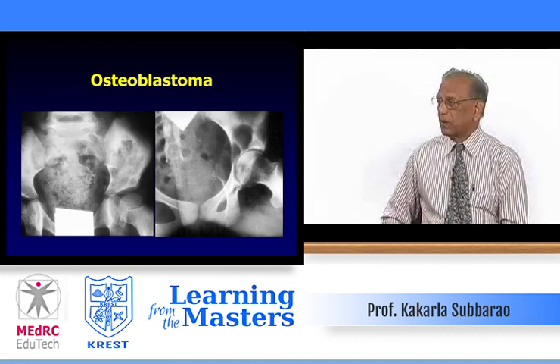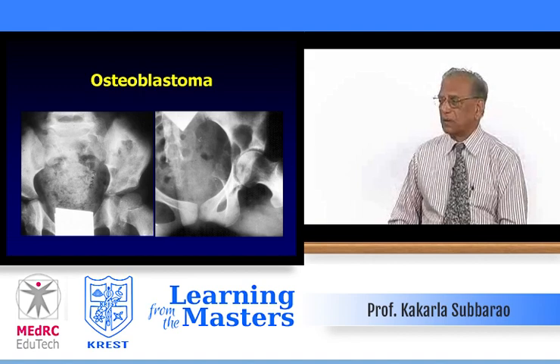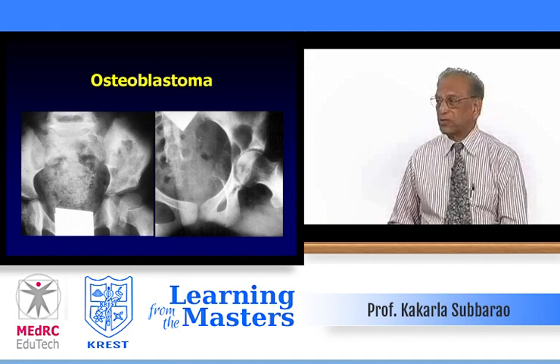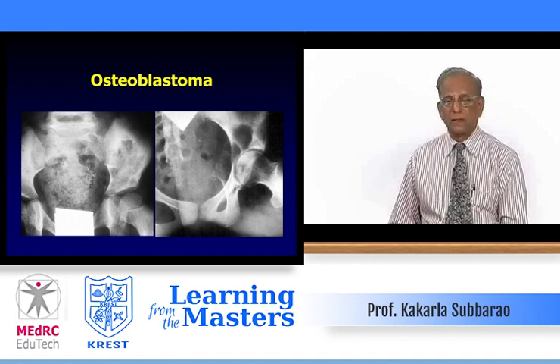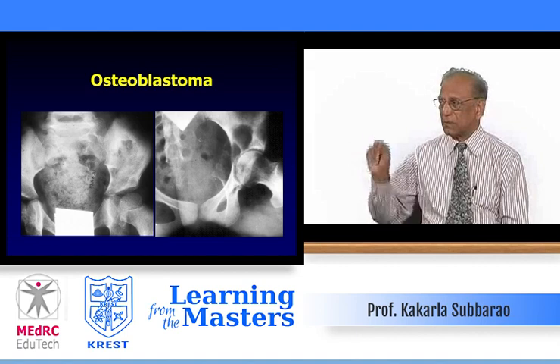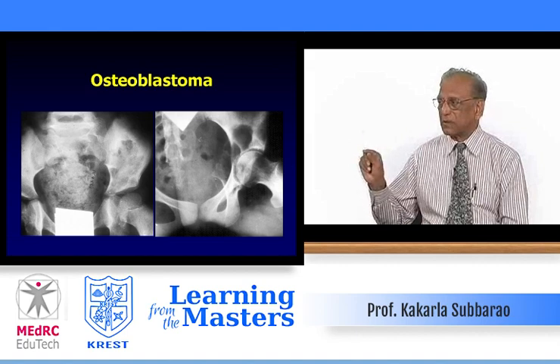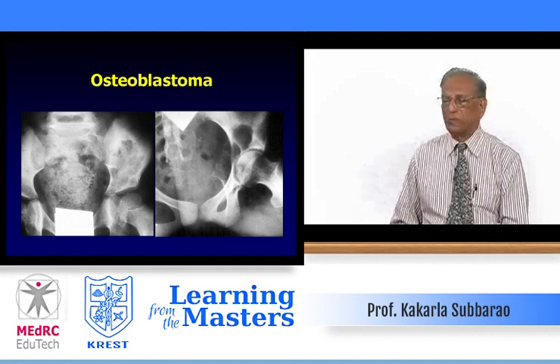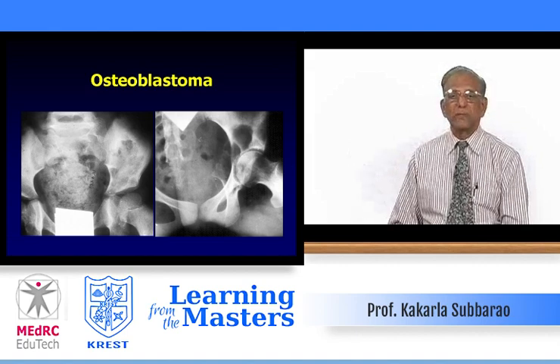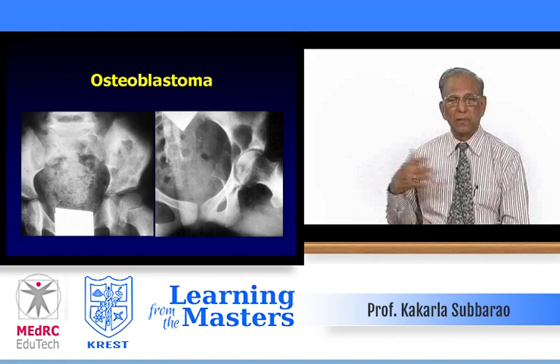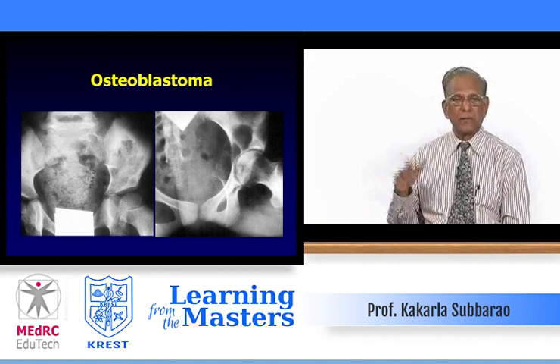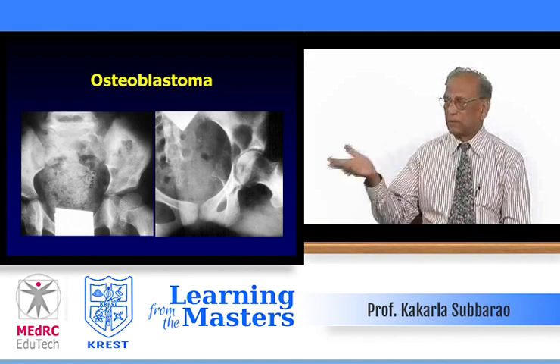Two pelves — on the left side, a child with a moth-eaten appearance and loose interiors involving the iliac bone. This is eosinophilic granuloma. The appearance is not typical, but you have to rule out other lesions. In the presence of a child, histiocytosis X should be considered.